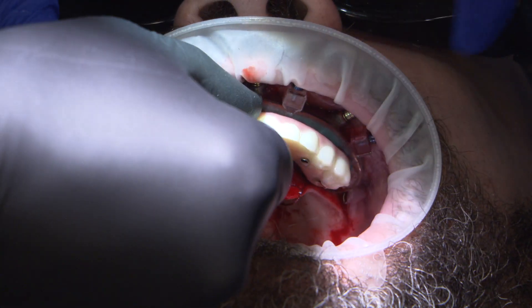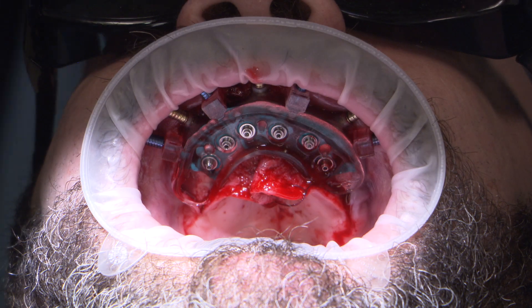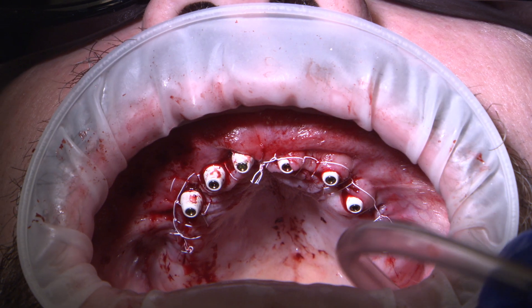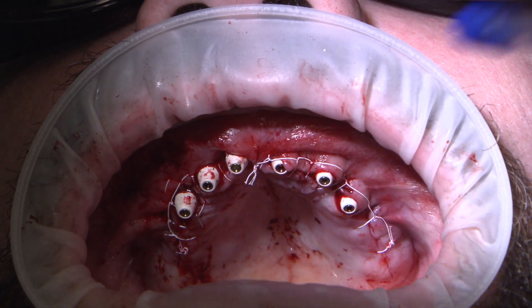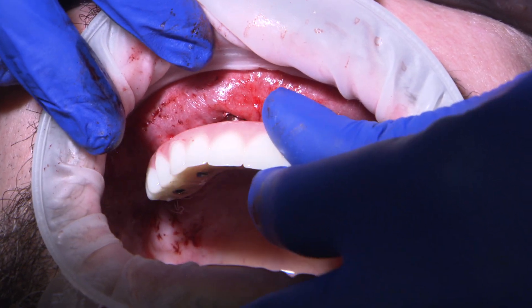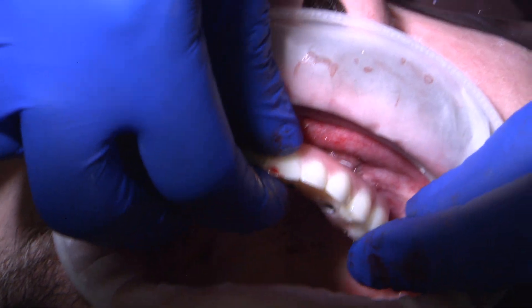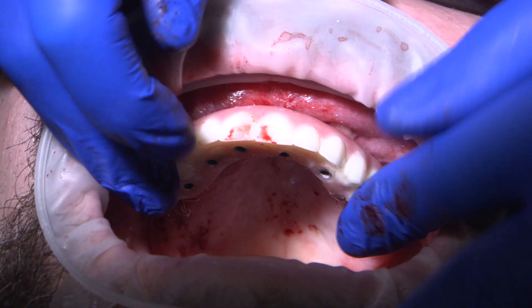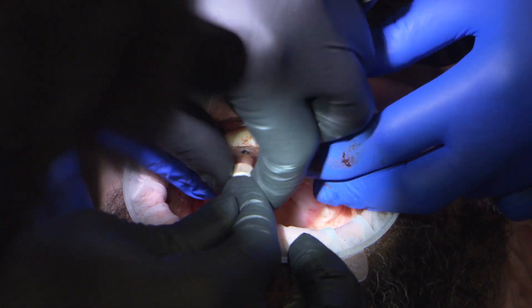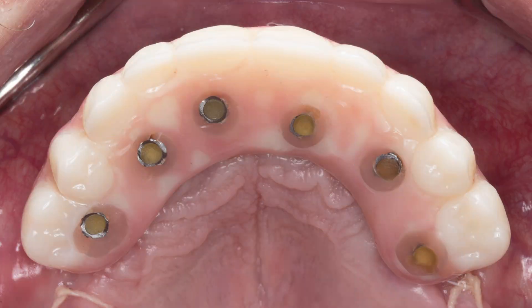The prosthetic delivery guide and gasket were removed. To assist in contouring and suturing of the soft tissue, MUA cover caps were hand-tightened into place. The anchor pins were then removed, allowing the foundation guide to be detached. Once suturing was complete, the MUA temporary healing caps were removed and the provisional was seated and torqued to 15 newton centimeters, which is the manufacturer's recommended torque value for these multi-unit abutment screws. Teflon tape was placed into the access channels to protect each of the prosthetic screws, and the access channels were then closed with a temporary material — Fermit was utilized in this case.